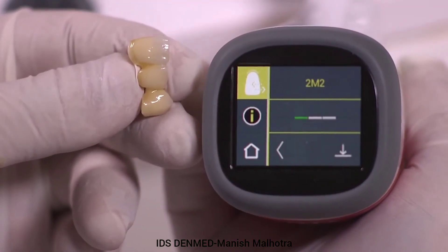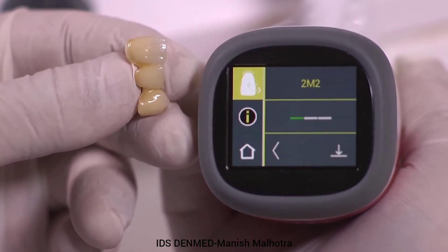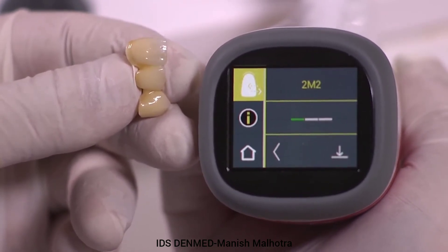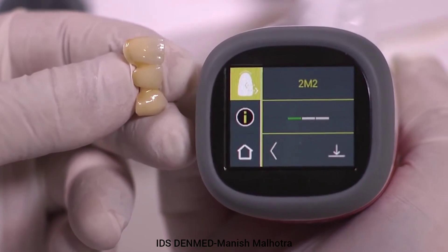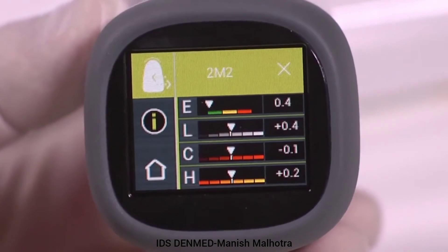Verify restoration results: Green — ideal result. Yellow — acceptable shade match for posteriors but not anterior restorations. Red — not an acceptable shade match. Extended information can be displayed by selecting the color bar.